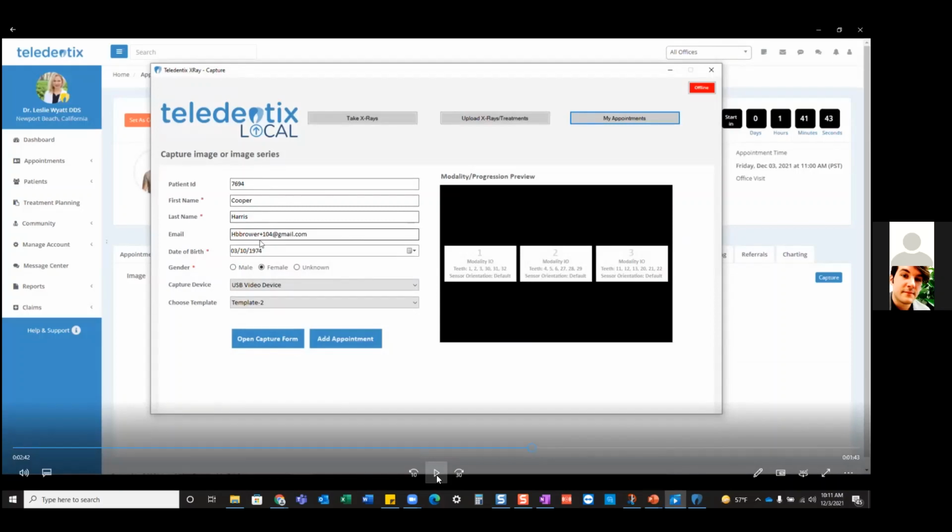One thing that I didn't show on this video, but I want to point out is, what if I have a new patient come in? What if I have someone that was like, oh, I didn't sign up, but do you have time for another patient? I don't want to lose out on that, right? That's production. That's another patient that I can start building a relationship with. Back when there was no offline capture, it was something that you just kind of had to cut your losses and sadly walk away.